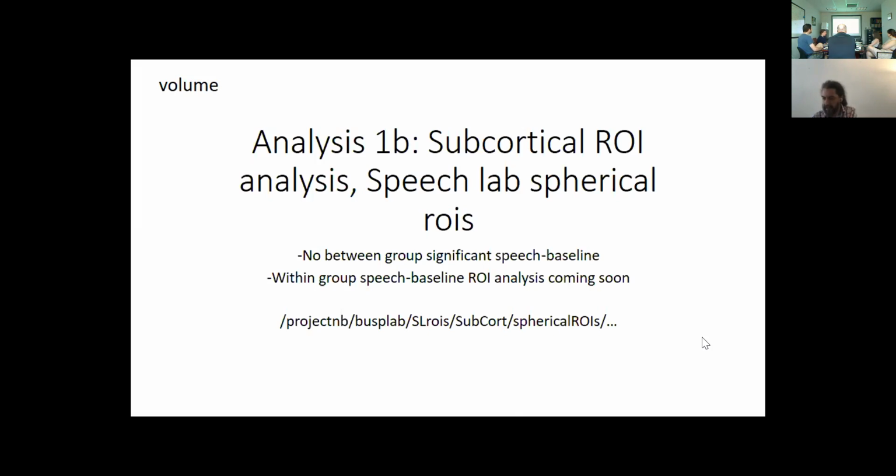Okay. And I've been using a lot the plotting that you showed us, just to look at each subject across the ROIs, because that helped me find one subject. I went and looked, and I realized they only have 15 bold files, and there's a reason that they look different, so then I had a concrete reason to remove them, and it took a lot of the variability out just based on the fact that I was able to look at it through the ROI. So that was really helpful to see. Okay, fantastic. Yeah. Okay. All right.